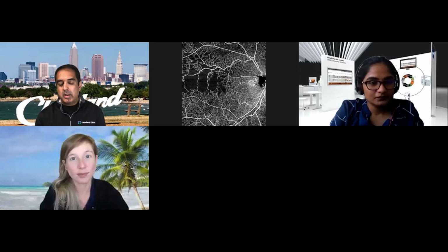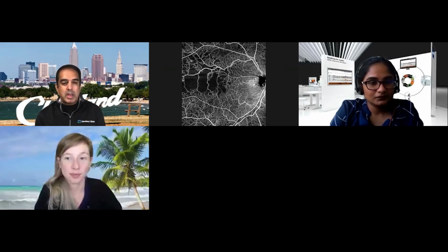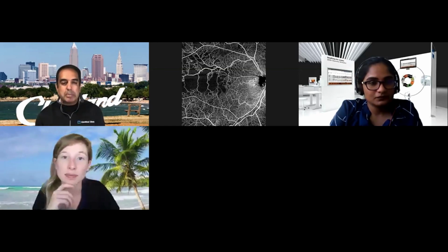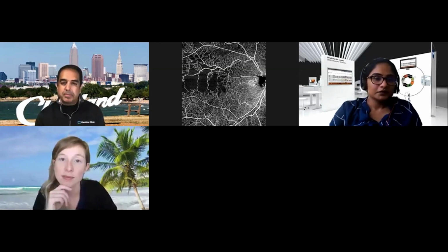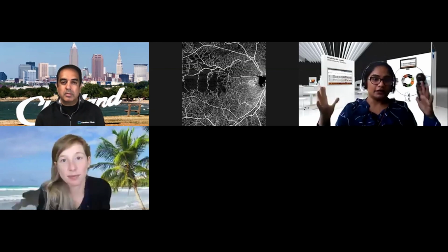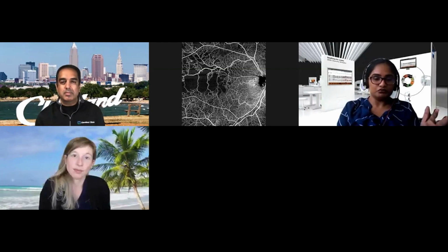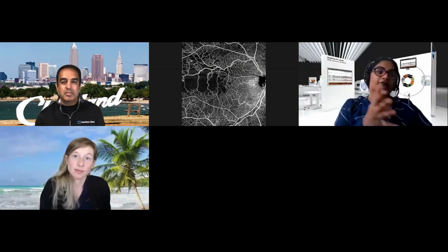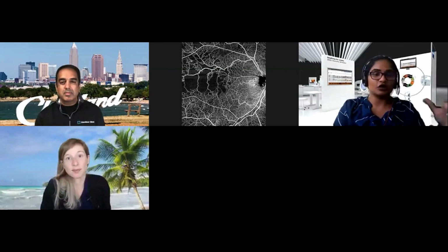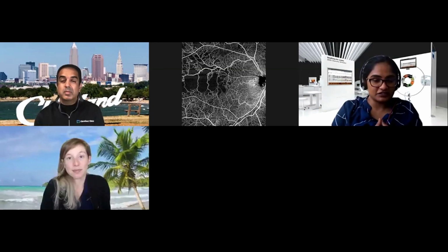And you brought up a couple of terminology points. I just wanted to make sure people understand. Can you define the difference between artificial intelligence and the terminology that kicks around, like deep learning, and what that means to people? So artificial intelligence is something really broad. If you're teaching the computer or any program to do something automatically by learning from some data, that's artificial intelligence. So Zeiss has been doing artificial intelligence, if I would say so, for the last 25 years.